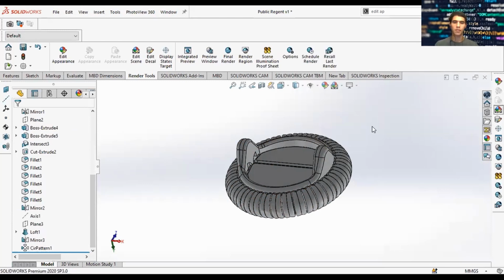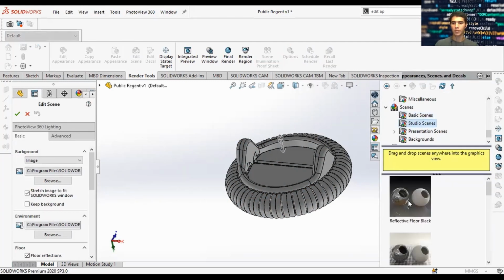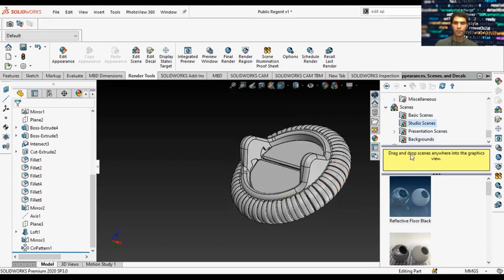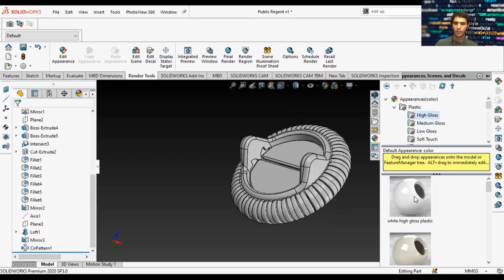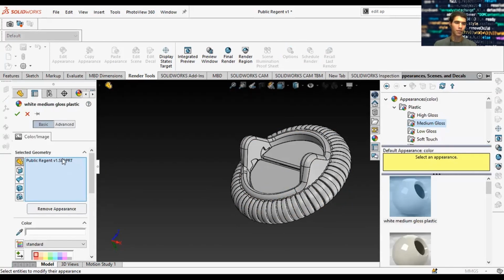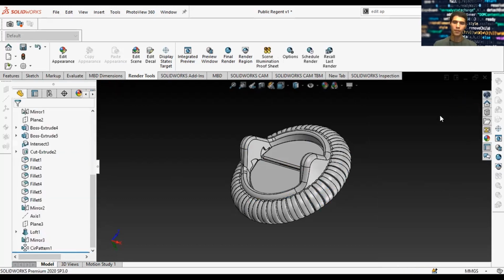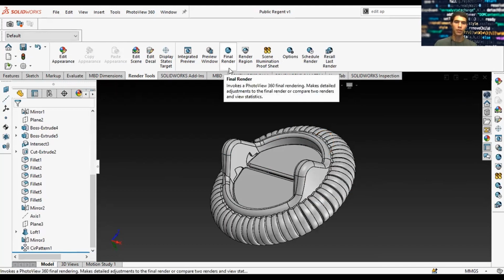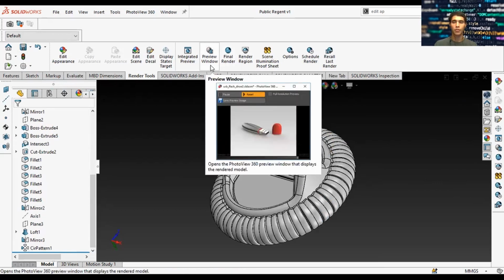Let's go ahead and go to edit scene. The one I like to use the most is the reflective floor black. There we go. So we have our scene and we edit our appearance. Let's see how this would look like in a render studio. So we will click final render, or we will click preview window. So go ahead and let me know if you guys can see this.